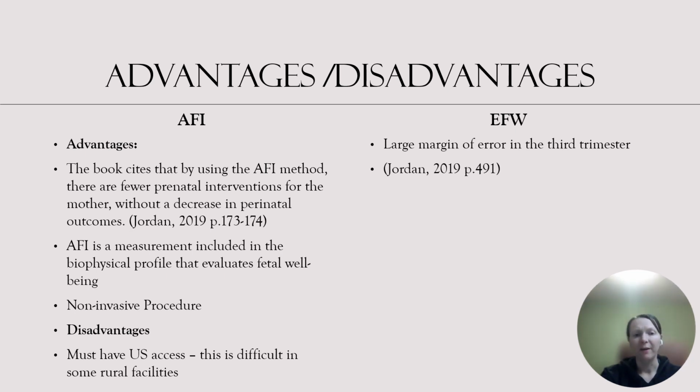Advantages of being able to do an AFI are that, when using AFI, the book did cite that we're able to look at the fetus using less interventions, but we're not having decreased outcomes. So it's a low risk intervention that may prevent us from having earlier C-sections, earlier inductions of labor, earlier interventions that may affect our outcomes.